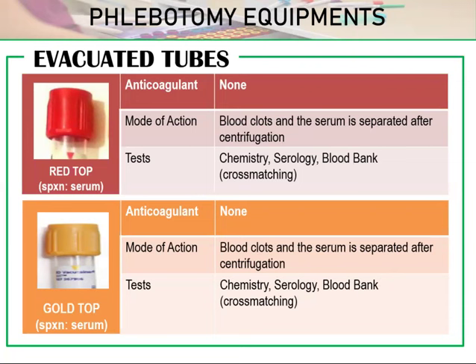It's because, class, on our glass, the natural characteristic of the glass is that it serves as the clot activator. Okay, once the blood touches the glass, it will immediately start the clotting process. Okay? Again, on the plastic, what is present is silica particles. And in the glass, there are no silica particles, because the glass itself is the clot activator.